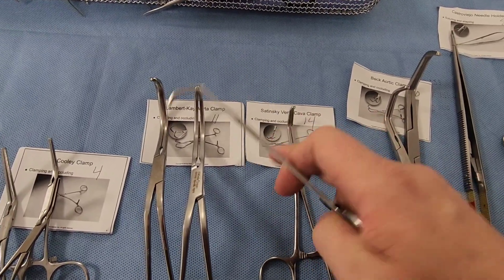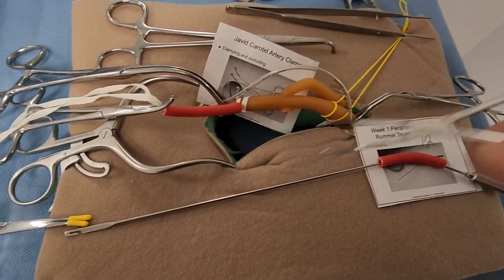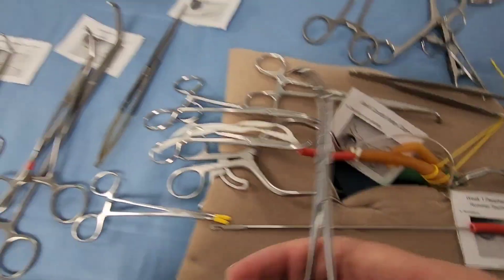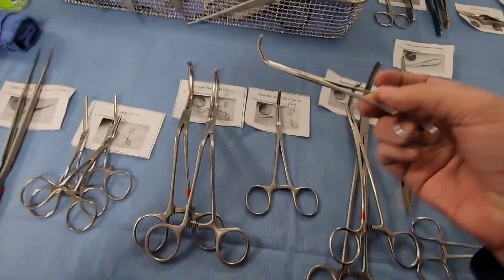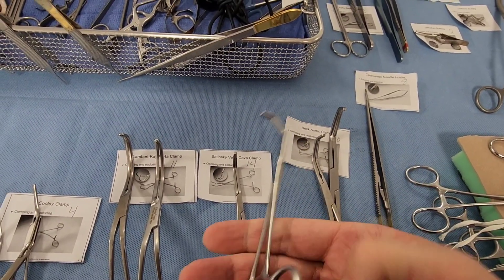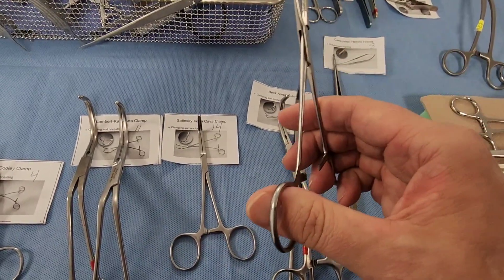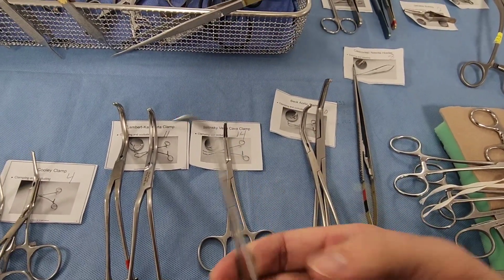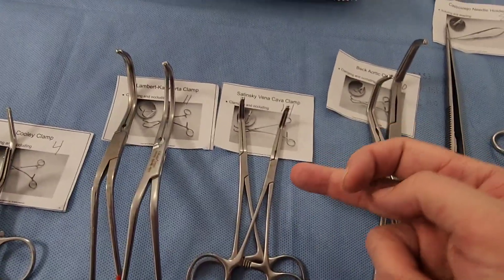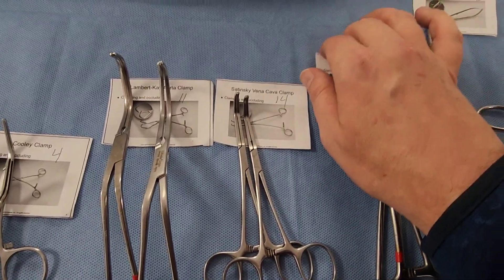The Satinsky vena cava clamp — as the name implies — comes in small and large sizes and can be angled to get around structures. It's designed to clamp off the vena cava. If you need to isolate the vena cava or medium-sized vessels, this is the tool for that job. It comes in a medium size but can also come larger.